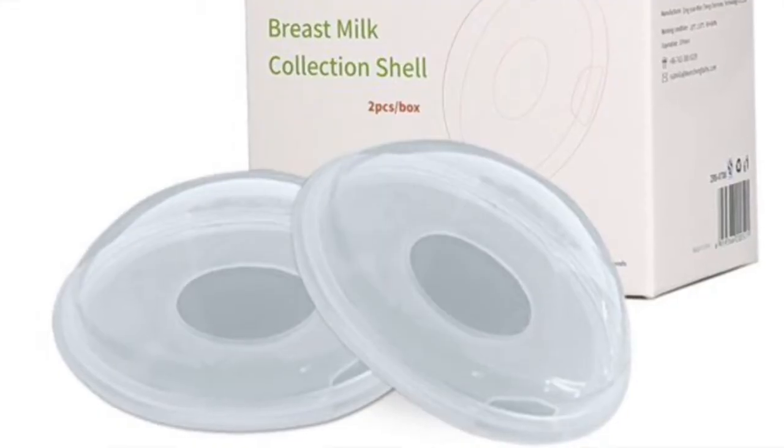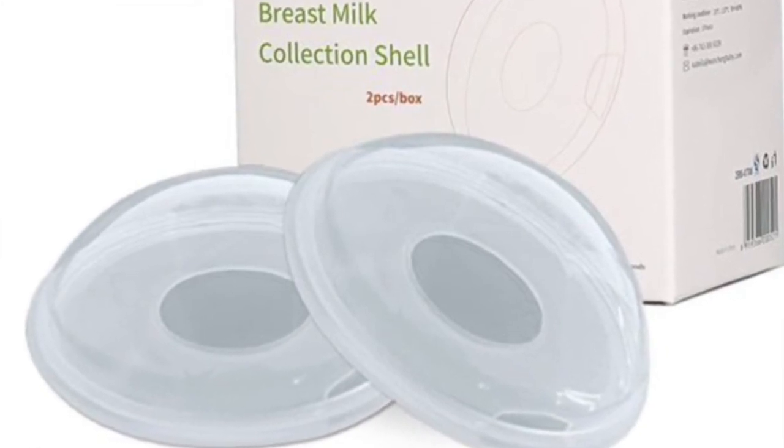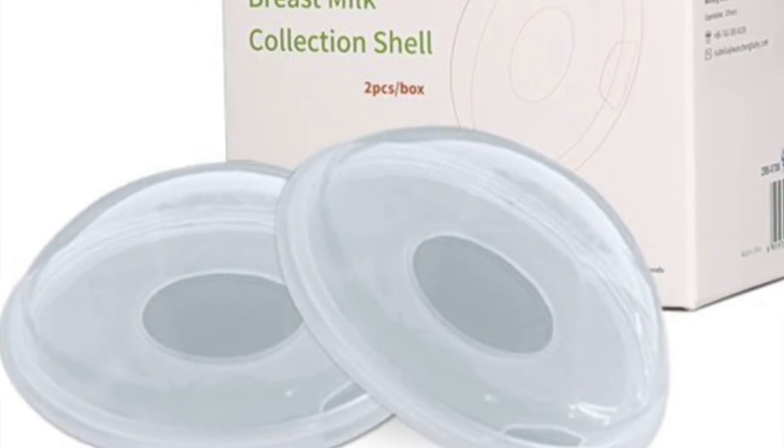You can wear supple cups under your bra. I'm going to put a picture of a breast shell up on the screen — that's what you would want to put over the supple cup if you're trying to wear it under your bra, so that your bra doesn't knock the supple cup off or break the suction. That way you can wear it for longer periods of time throughout the day.